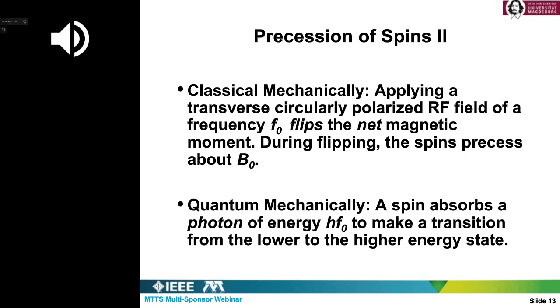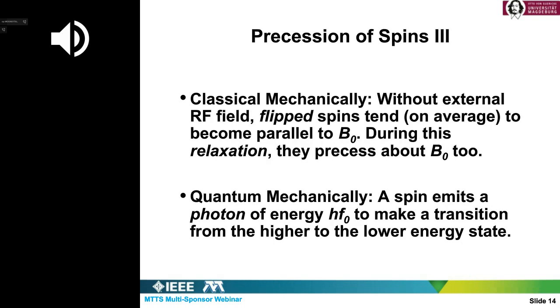And then when you stop this exposure, thermal equilibrium returns, and the spins come back with more lower energy than higher energy. Of course, we are not talking about a particular proton. We are always talking in the sense of the average. If you follow just one particular proton, it jumps between higher and lower stochastically. But we describe here the statistical average.